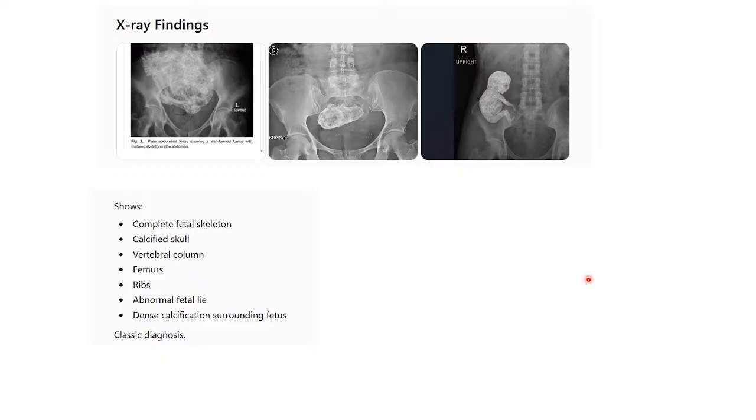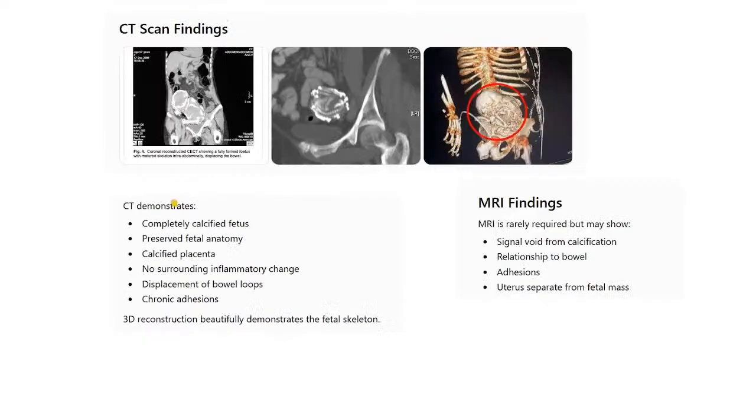Have you ever heard about it? Have you read about it? Or is it your first time? I'm asking you, the medical community, the sonographer community, the radiology community. What's your take? Have you ever seen this during your years of experience and work?